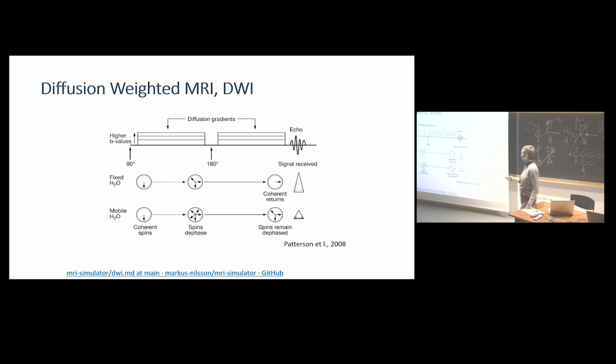We know that there is dephasing going on, and that this dephasing is reversible, so we can get back our full signal in the end. And what we do is that we exasperate the system in some way because we apply an additional magnetic field to dephase these spins even more. So we dephase them really much, but after the 180-degree pulse, we rephase them again with a gradient of the same polarity.